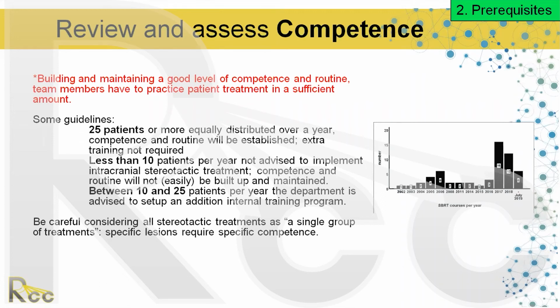Is there a center that does it 20 times, 50 times, that might be a better service to the patient? These are just things to consider. These are some guidelines: they say 25 patients or more. If you're doing less than 10, it's not advised. If you're doing between 10 and 25, you should have some kind of periodic check-ins to ensure that you're supplementing your knowledge.